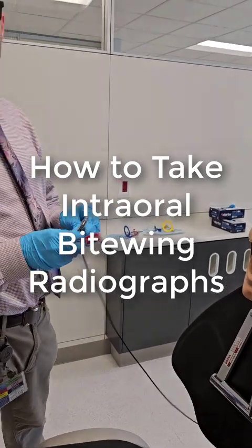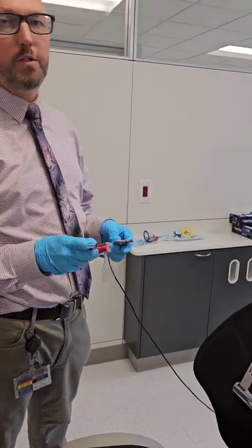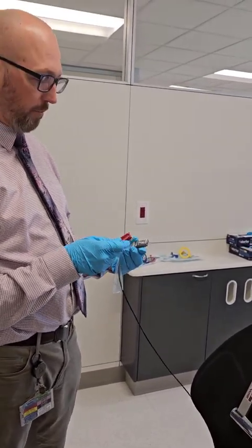All right, last but not least, we've got bite wings. I usually tend to save these for last. They are most tolerable for the patient, so if they've had a difficult time, you're still usually able to follow through and finish up if you do the bite wings last.